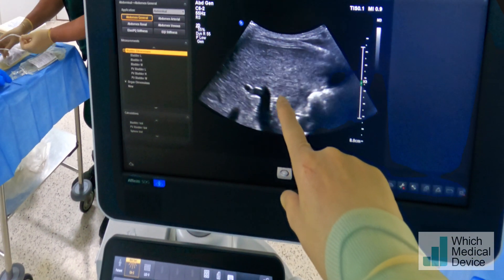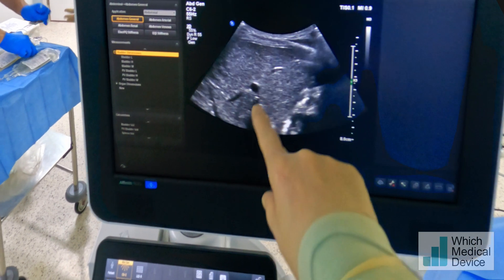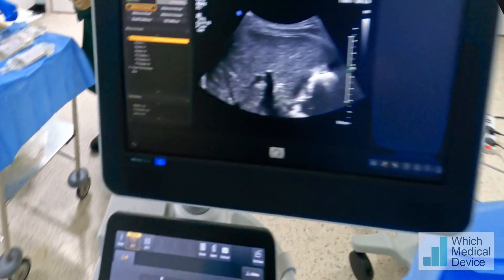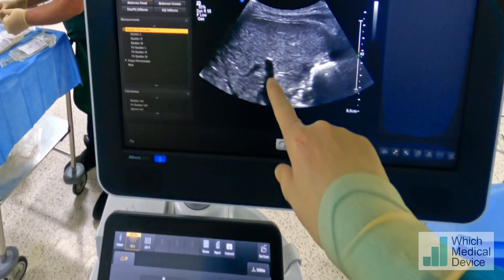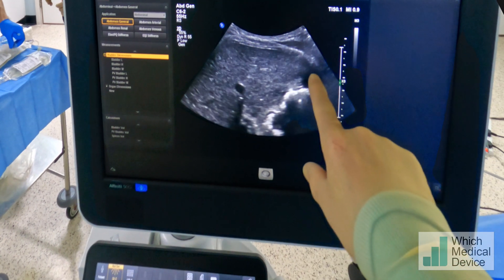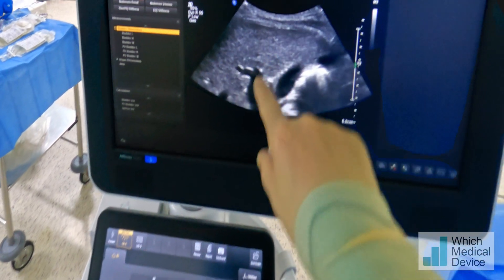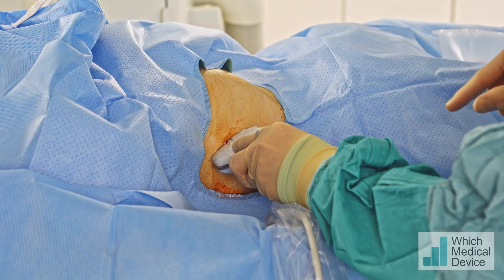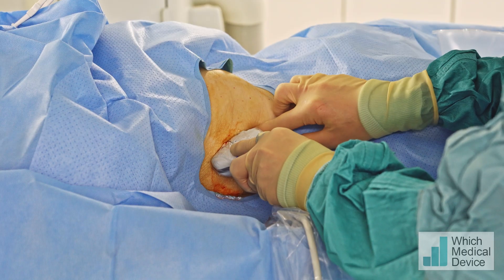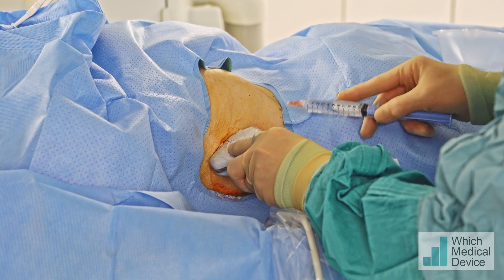I'm going to look with the ultrasound again. The first thing we're going to do is select a branch of the portal vein or even the main portal vein. We can see it just here with a branch going superiorly and one going inferiorly. We're going to aim for the main part of the portal vein. I'm going to put some local anaesthetic into the skin, so there'll be a little sharp scratch now.